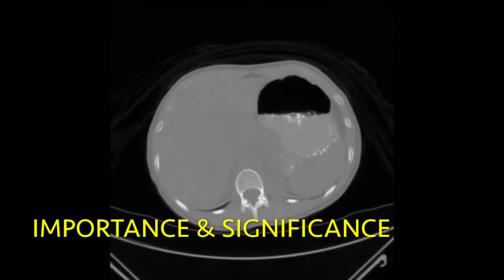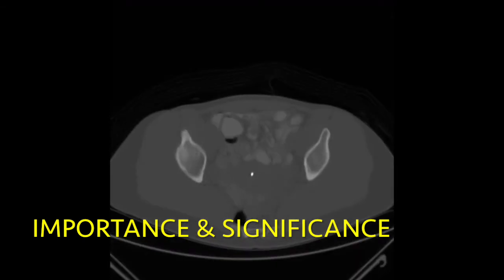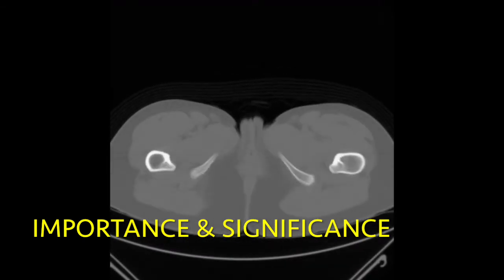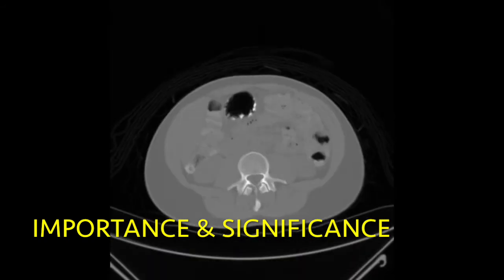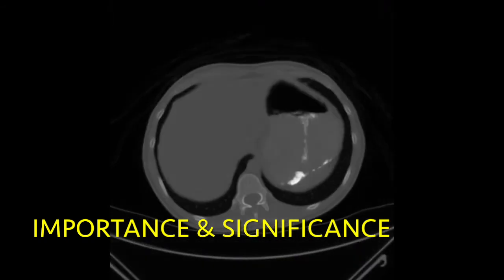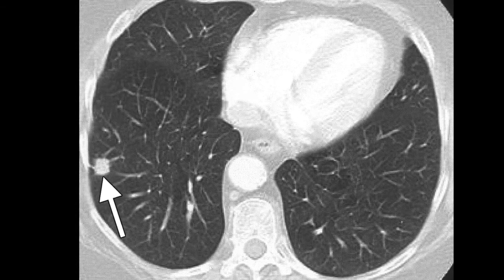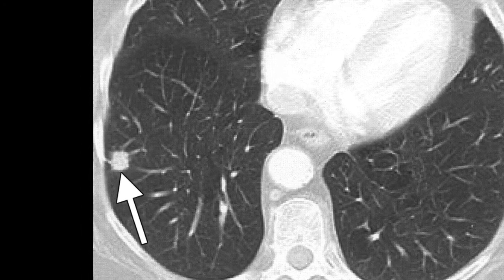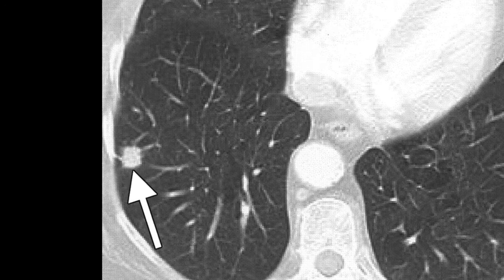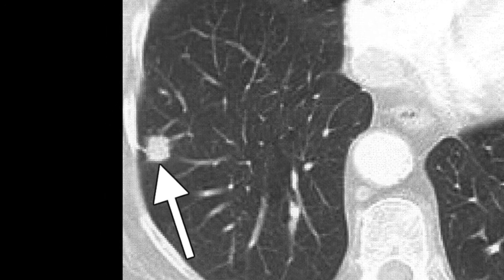The use of several layers of images allows for finer details to be seen. This is particularly important in the diagnosis of various cancers, in particular asymptomatic lung cancers. In early stages, cancers may exist as growths less than 5 mm in size, which cannot be picked up by certain techniques such as X-ray imaging. However, the detail that CT scanning provides makes it easy to detect cancers at an earlier stage when they are much smaller in growth.